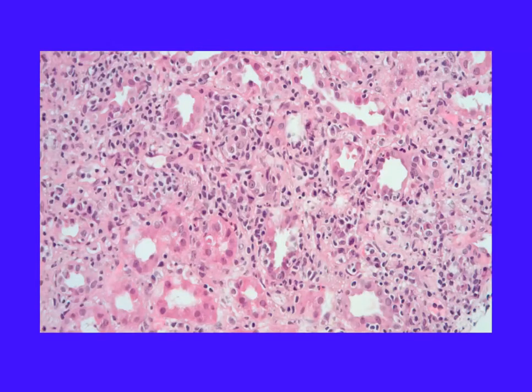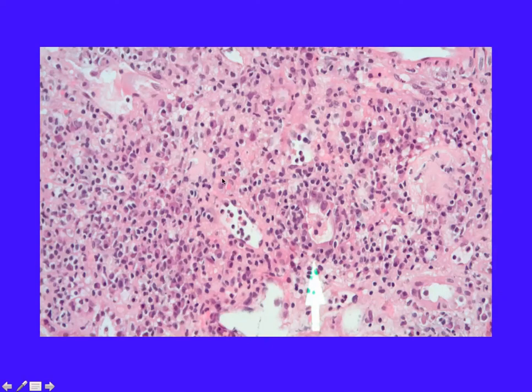In the more severe cases, we may have tubular profiles which are not involved by inflammation at all, but then again, this adjacent tubule here shows involvement by small lymphocytes that cross the tubular basement membrane and create an artifactual clear halo around their nucleus, which makes them easier to detect by the pathologist. Similar case of severe acute cellular rejection with a heavy mononuclear infiltrate present in the interstitium, and marked severe tubulitis with more than 10 mononuclear cells involving this tubular structure.